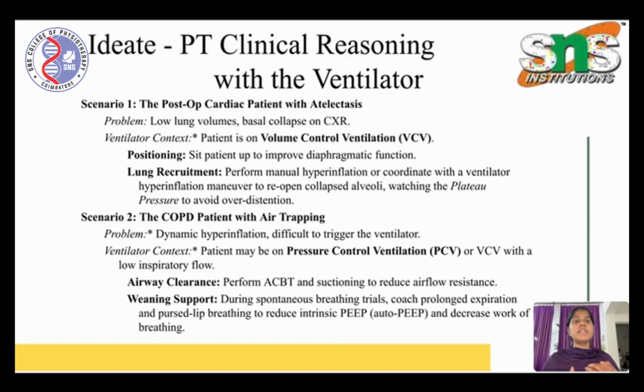Scenario 2 is a COPD patient with dynamic hyperinflation struggling to trigger the ventilator, possibly on pressure control ventilation. Perform airway clearance with ACBT and suctioning, and during weaning, coach prolonged expiration and pursed lip breathing to reduce the intrinsic PEEP and ease breathing.